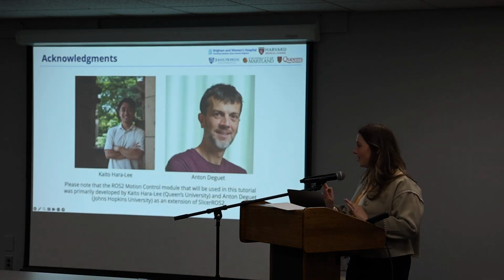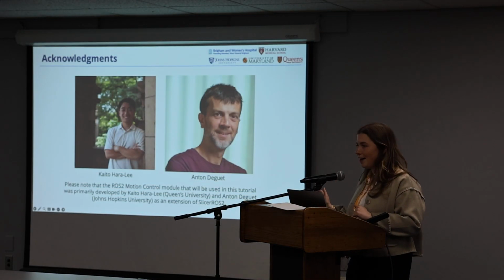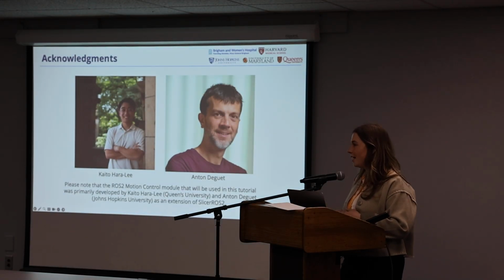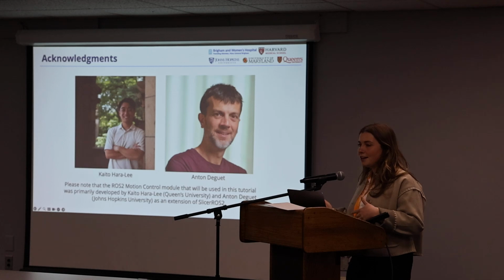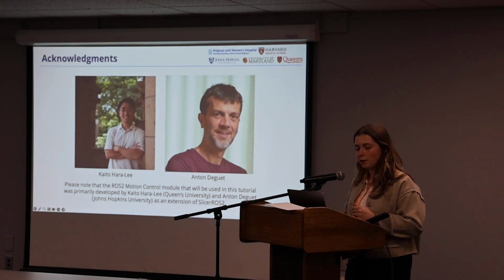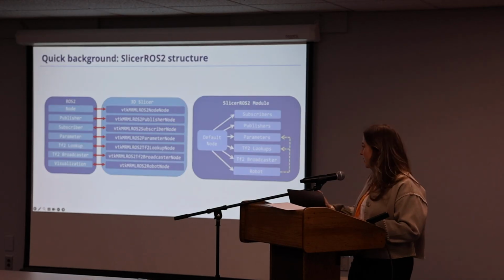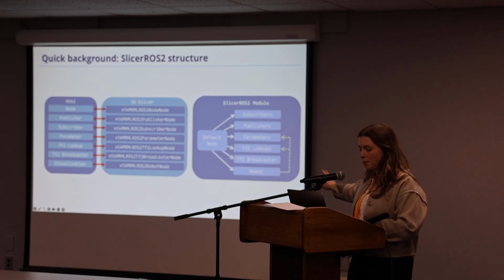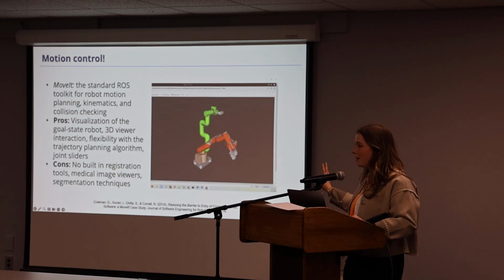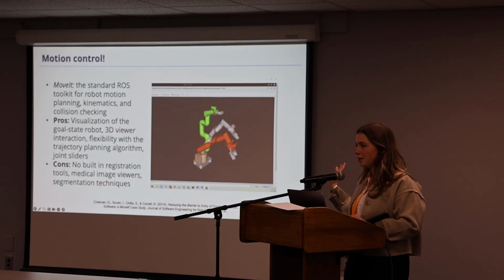And I want to start by giving a shout out to these two people. Kaito is a master's student at Queens. He developed the motion planning module that we'll be using today, and Anton is the maintainer of SlicerROS and was one of the core developers. The two of them have been working hard to get this working. As I said, we had this basic functionality before. Now we added motion planning to that. You may already be familiar with MoveIt if you've worked with ROS at all.